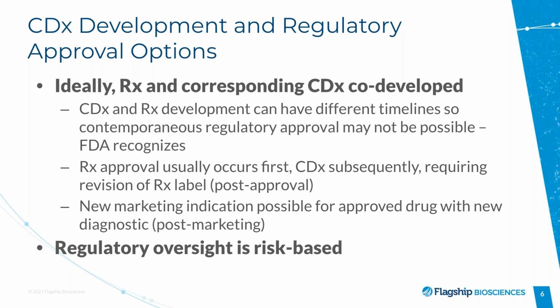A new marketing indication is possible for an approved drug with a new diagnostic, also in the post-marketing period. Regulatory oversight in any case is risk-based.